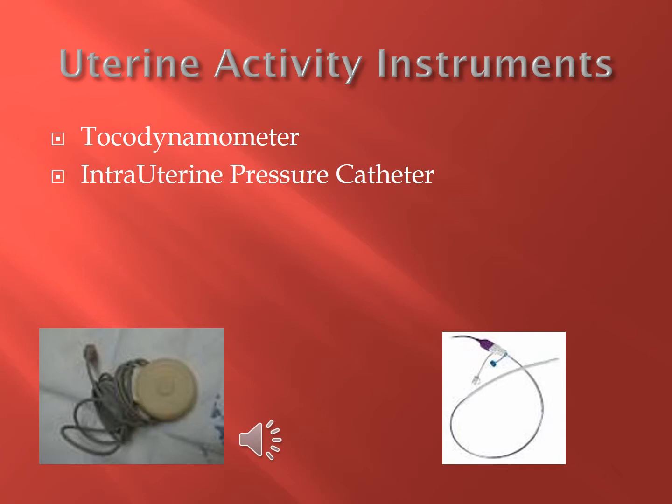The intrauterine pressure catheter is a direct method for monitoring uterine activity. It directly measures resting tone, contraction intensity, frequency, and duration. It requires rupture of membranes and cervical dilation. The limitations are that there is a risk of infection and it restricts maternal ambulation.